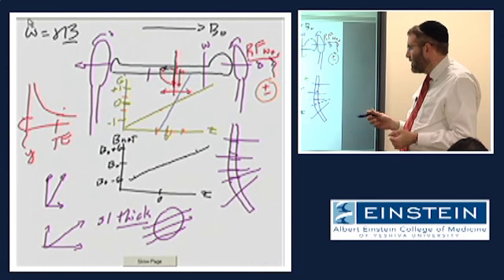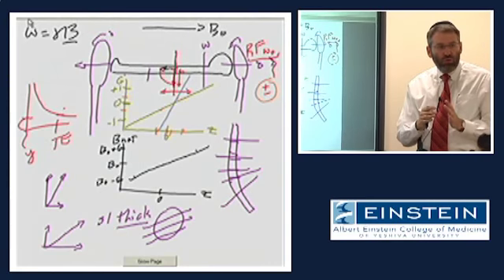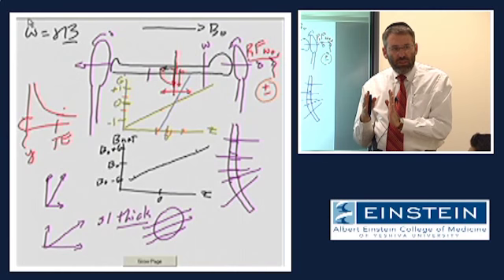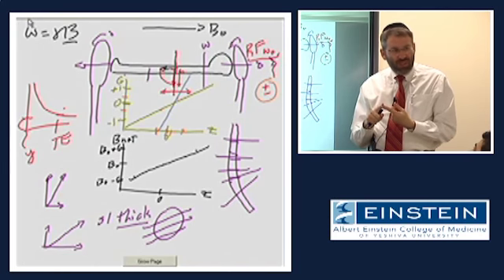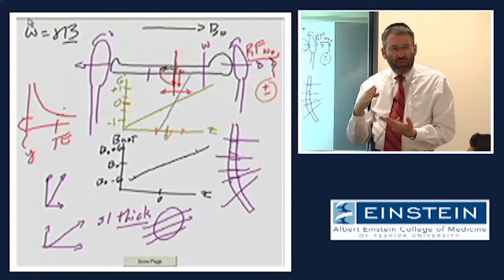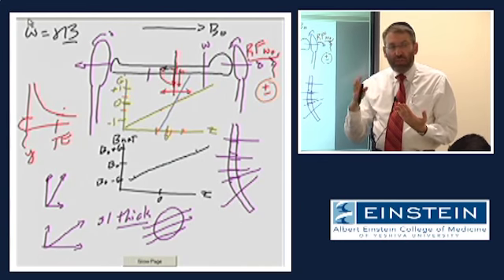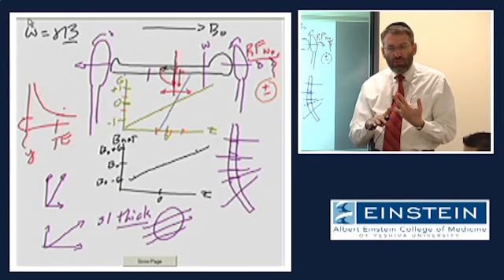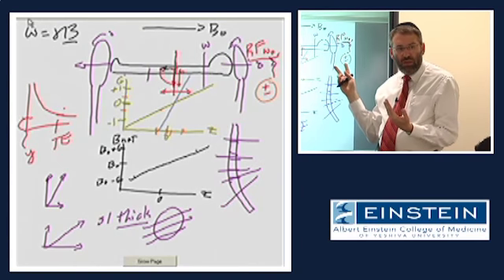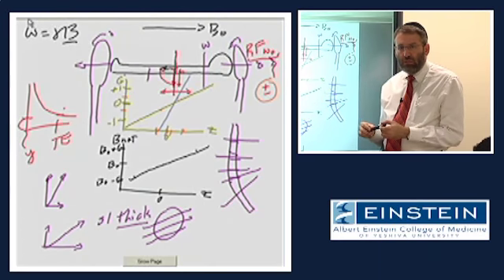Okay, so this really finishes off our ability to have full control over excitation of a slice. We've been able to, first of all, just select a slice, identify its position along the gradient magnetic field, change its orientation by applying different combinations of multiple gradient magnetic fields, right? And finally, adjust the thickness based on either the range of frequencies that we transmit or the amplitude or slope of the gradient that we apply.